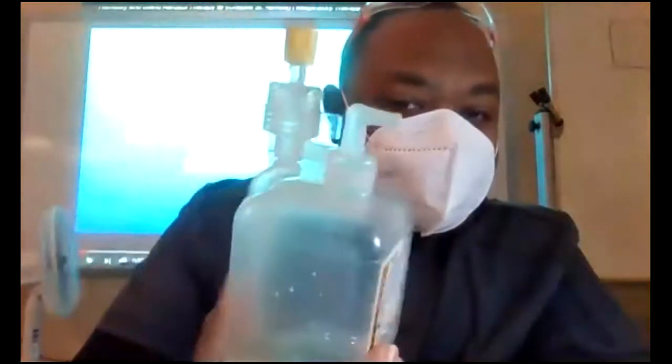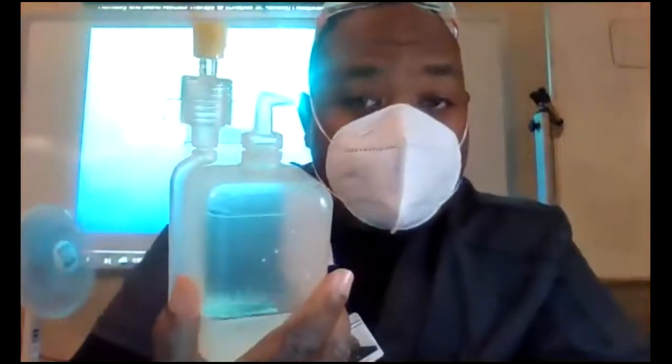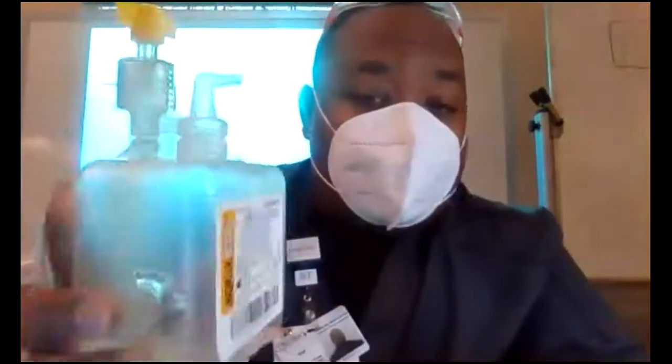And now, for some reason, this is yellow. Sometimes they make them yellow, but this is for oxygen only. It's not for air. Okay, there's no reason to get humidified air in your nasal cannula. There's no reason for it, okay? So I don't know why they make it yellow. That's stupid, but they do. So this goes to oxygen, and this is it.